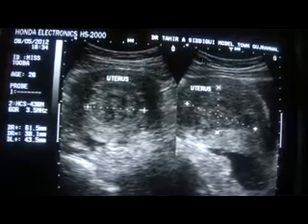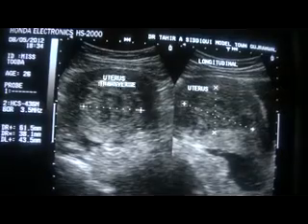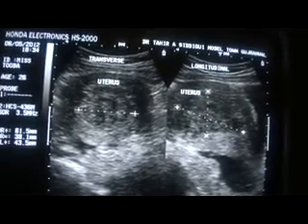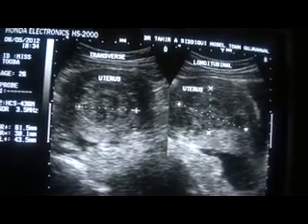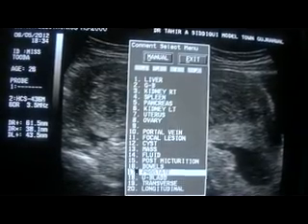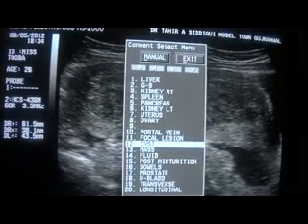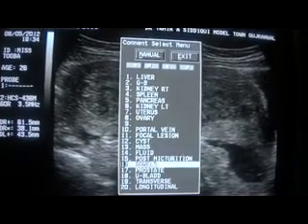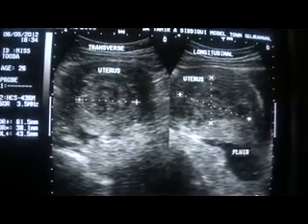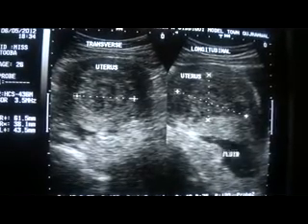So in fact this is a pocket of fluid that communicates with the free fluid below the uterus. Now this is the free fluid with echoes. This is the transverse section. This is the endometrial canal. Note the amount of fluid. Significant amount of fluid is seen posterior to the uterus, and this fluid then becomes a part of a cystic loculated pocket of fluid. Here it is.